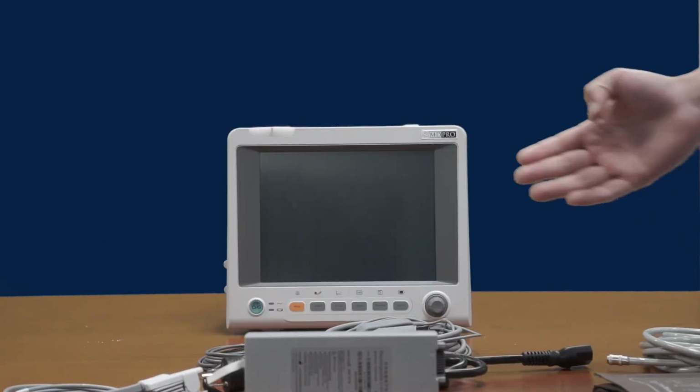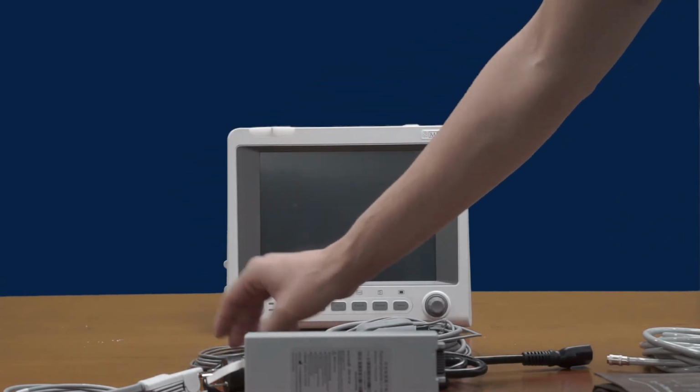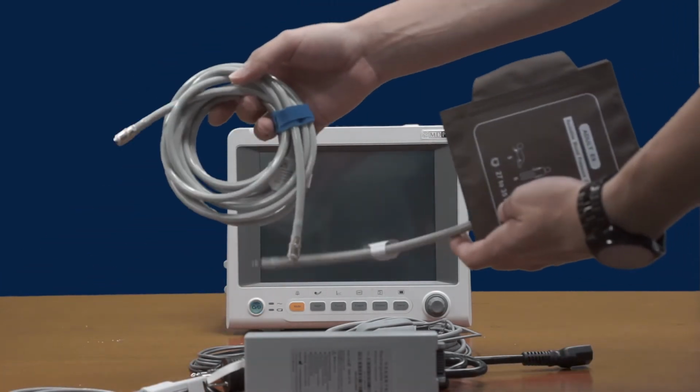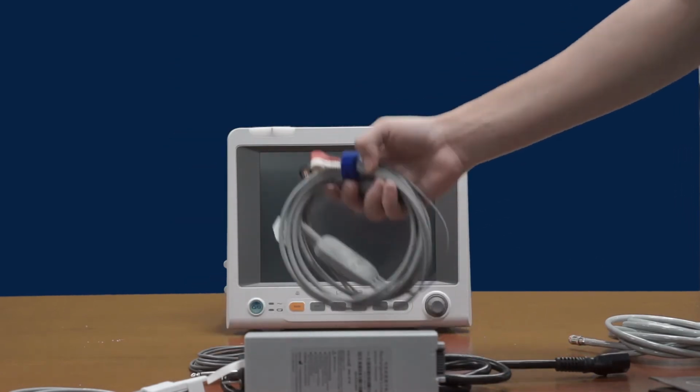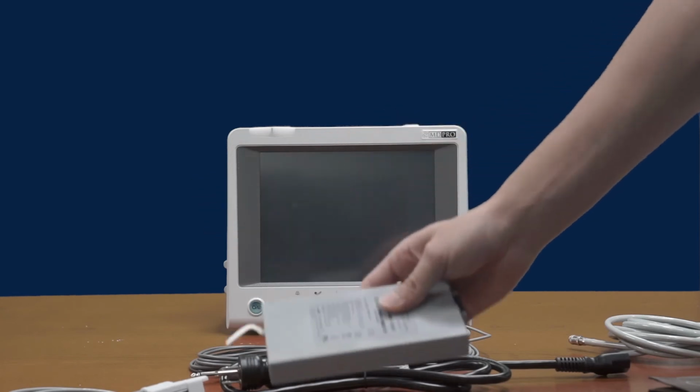Some of the standard accessories that come with a patient monitor, such as this, would include skin temperature probes, reusable SpO2 sensors, NIBP tubing and cuff, power cables, and a 3 or 5 lead ECG cable. This patient monitor also comes included with a battery.